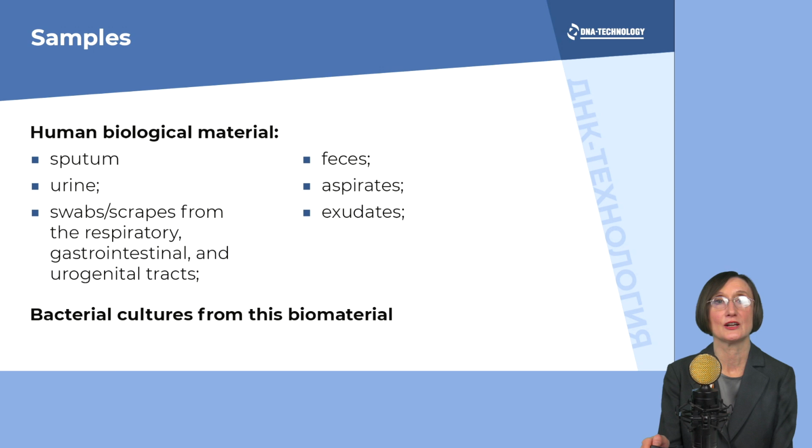Different human biological material can be used for testing. All options are presented on this slide. It's important to know that testing by means of real-time PCR is less demanding on the conditions of storage and transportation of the specimens compared to other diagnostic methods. That makes the procedure more robust and allows the decentralization of sample collection.